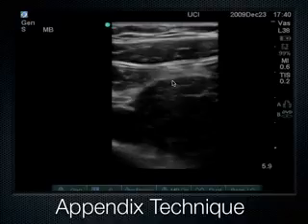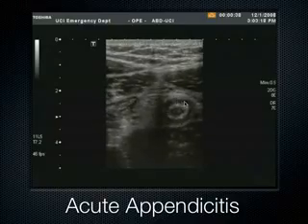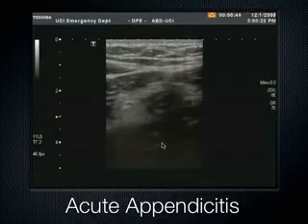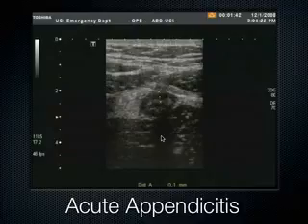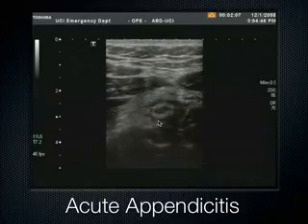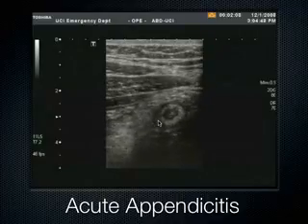And this is what a positive appendix looks like coming up. This is acute appendicitis. This is what happens when you compress the psoas musculature down here, and that appendix gets sandwiched between psoas and abdominal wall musculature. Notice there's some periappendiceal inflammation. We see on ultrasound it looks very hyperechoic, and they're measuring this appendix. I think it comes out to like 9.7 millimeters, which is greater than 6 millimeters. So it's a non-compressible tubular structure in the right lower quadrant that, outside wall to outside wall, measures more than 6 millimeters.